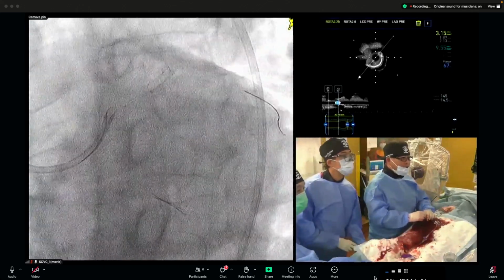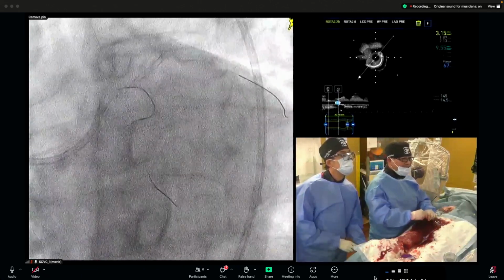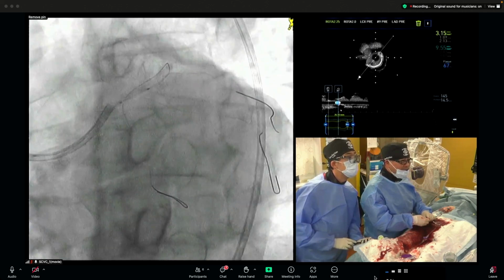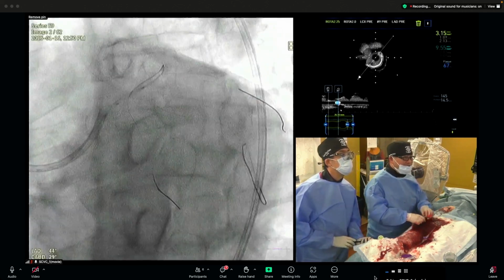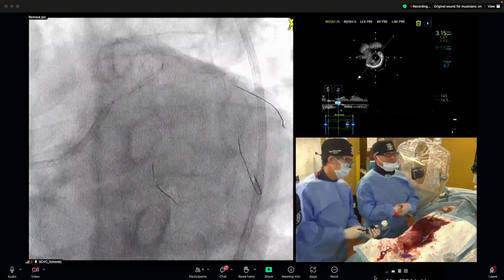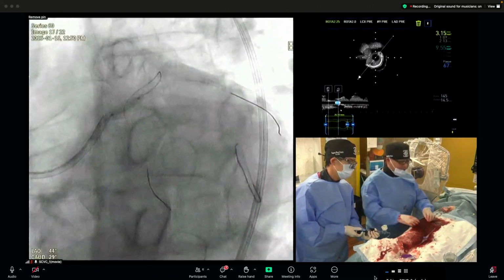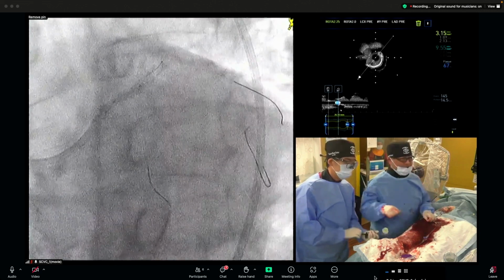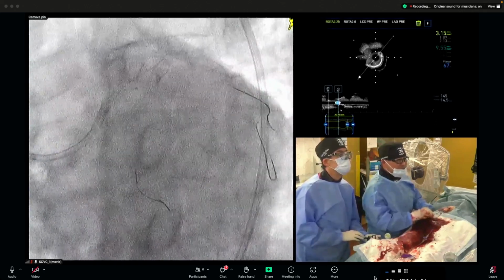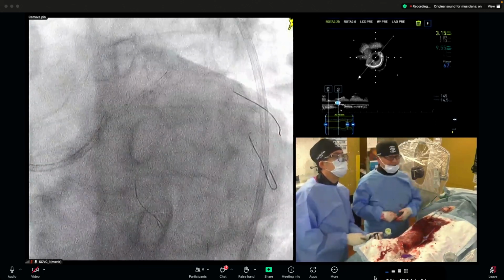Sorry, now the wire is twisted, so there are three wires. Too many wires actually, because the two main vessels are branching. The risk is very, very low. Usually I use only one wire for this lesion. Inflation, please. Yes, of course, it's a good option, but I don't want to take even a 1% risk for the patient. So deflation. That is my strategy. But of course, if the twist is so severe that I cannot deliver the balloon, I remove the side branch wire.